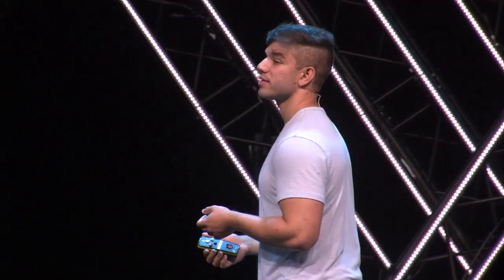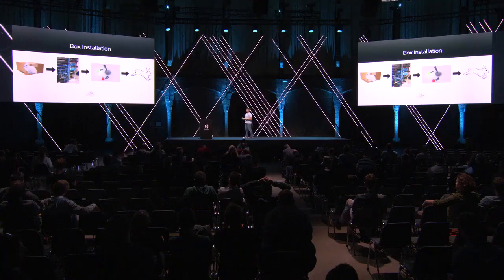Next, box installation. So you may have questions about how we actually deploy these boxes to our clinics and how the installation process is. Integrating with on-premise environments can be quite difficult, especially if you don't control all points of the process. But our current process is we'll build the Whiterabbit box in-house. We'll deploy it to a server room that's hopefully a lot cleaner than the one in the picture. And then the clinic staff just simply have to plug it in to a redundant power supply, as well as an actual power supply, and just turn it on.